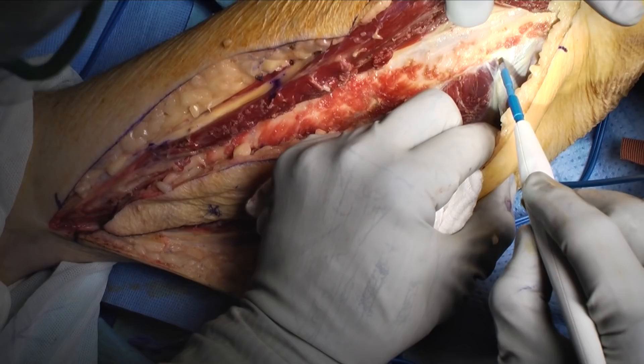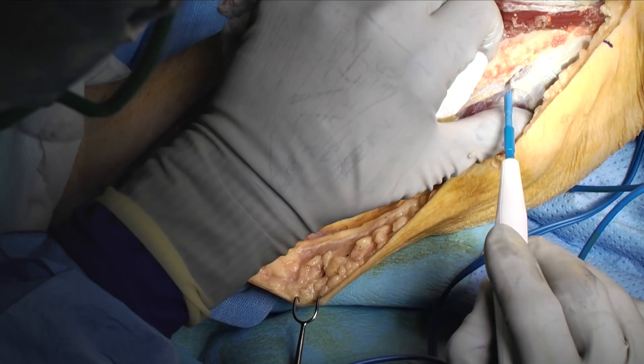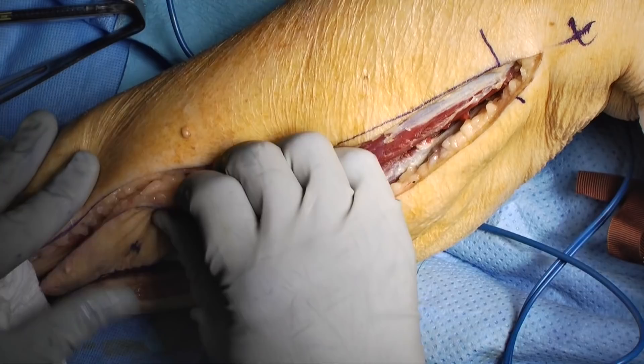This portion of the procedure involves taking the gastrocnemius and soleus loose from the fibula, done with careful dissection along the posterior fibular border. There are large perforating vessels that come off the peroneal vessels to the gastrocnemius that may need to be divided and clipped. These are usually proximal, in the proximal half of the fibular dissection.